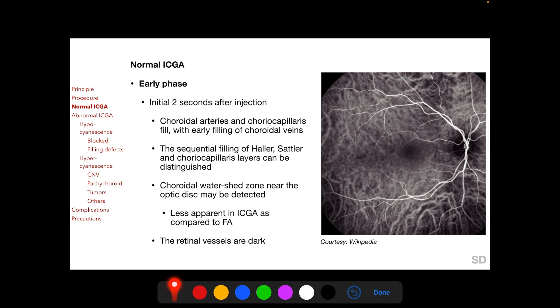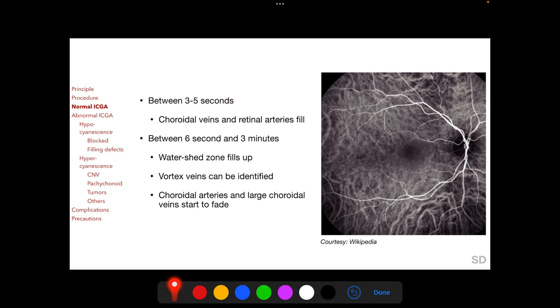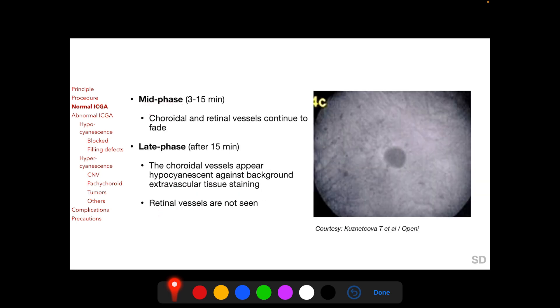In contrast to fluorescein angiography, in ICGA the optic disc area appears relatively dark, and the foveal avascular zone appears less dark because the longer wavelength light better penetrates xanthophyll and melanin. Between three to five seconds following injection, the choroidal veins and retinal arteries fill completely. Between six seconds and three minutes, the watershed zone fills up and vortex veins can be identified, while the choroidal arteries and large choroidal veins start to fade. In the mid phase, between three and fifteen minutes, the choroidal and retinal circulations continue to fade.